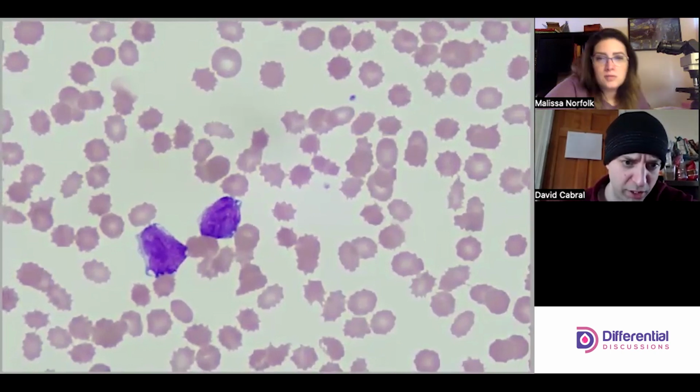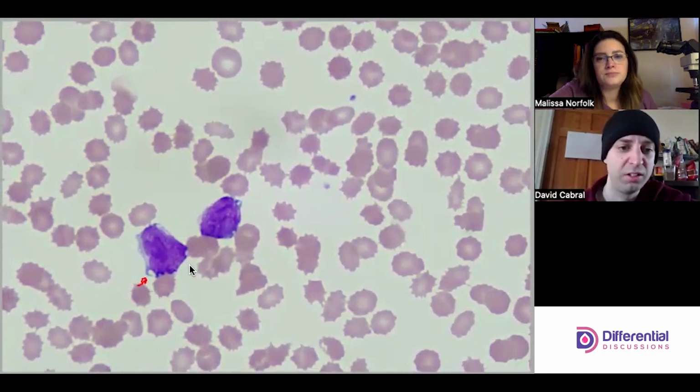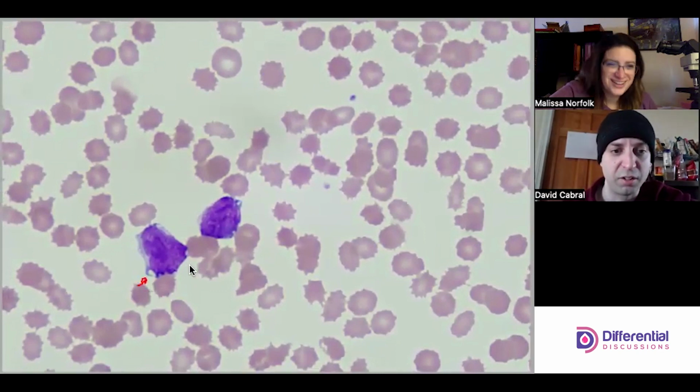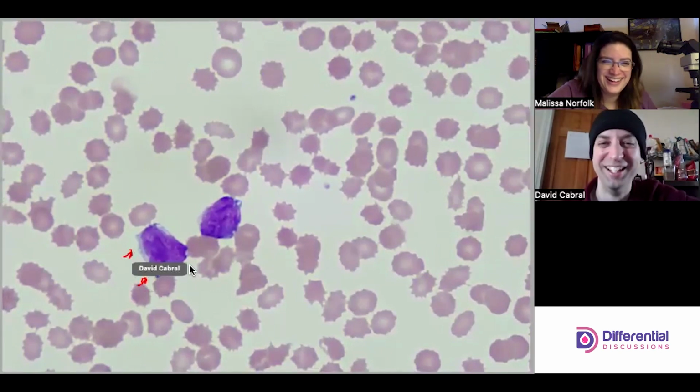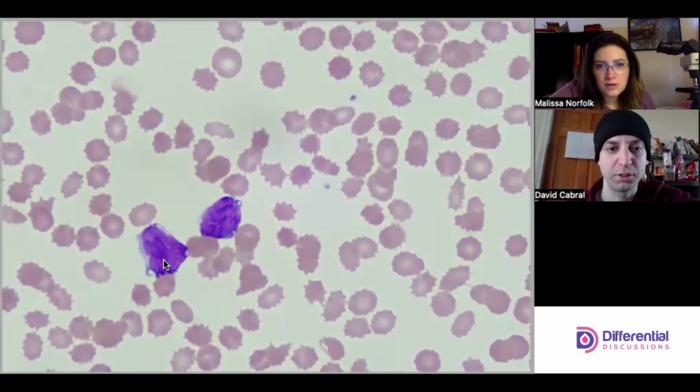So we have a weird abnormal vacuole down here. It looks like there might be one here too. So we've got multiple vacuoles, and even in the corner here. The thing I can't get over is the variable staining in the nucleus, like these shapes in this whole area. Very, very unusual, consistent with malignancy. And then its partner in crime next to it, demonstrating a lot of those irregular patterns. That one's so prominent, it almost looks like folding, right?